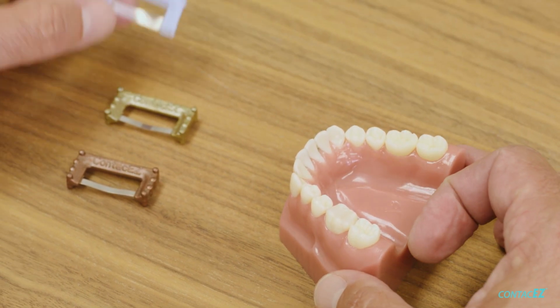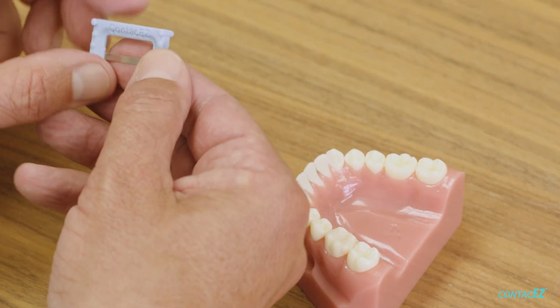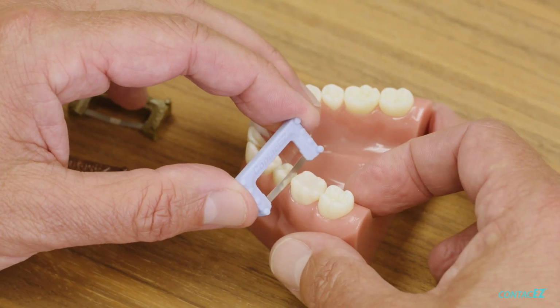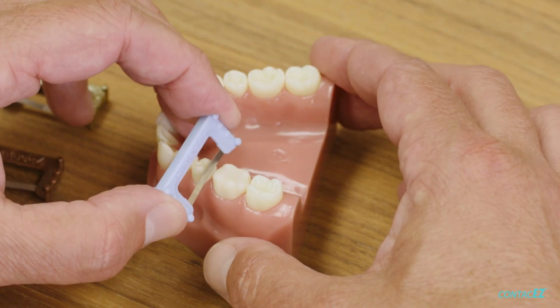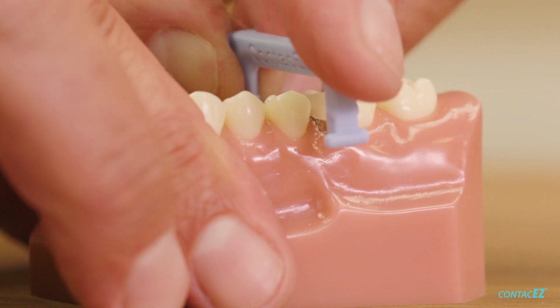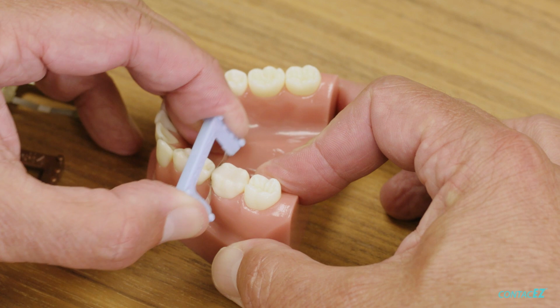So we're going to use our blue narrow strip, the cutting one. Again, this has no diamond on either side, so we're not affecting the contact. All we want to do is get here and do some cutting. Again, we can do it on the bottom of the strip or the top of the strip since both sides are serrated. So we work our way through. And of course, we don't have real subgingiva here because we don't have real gingiva.